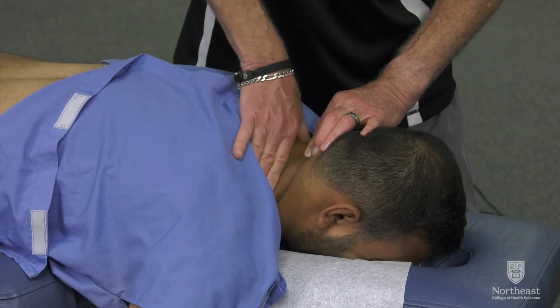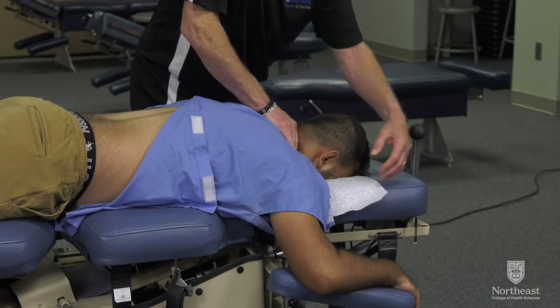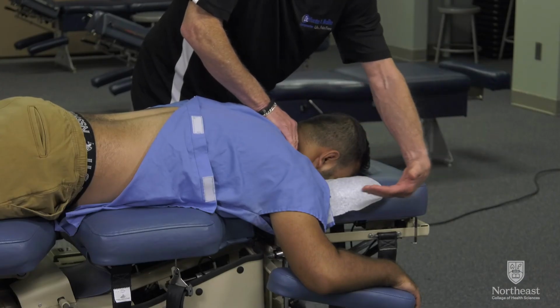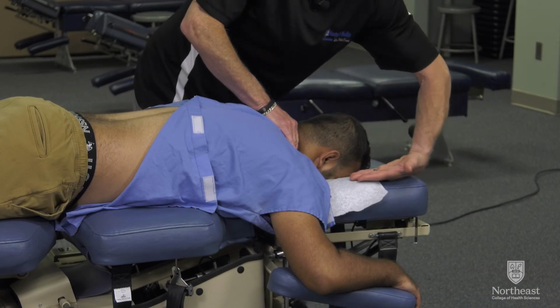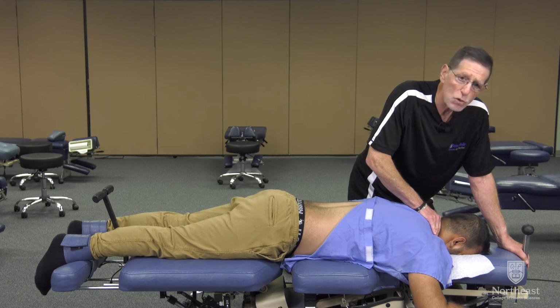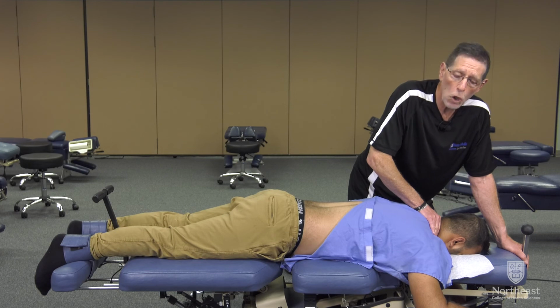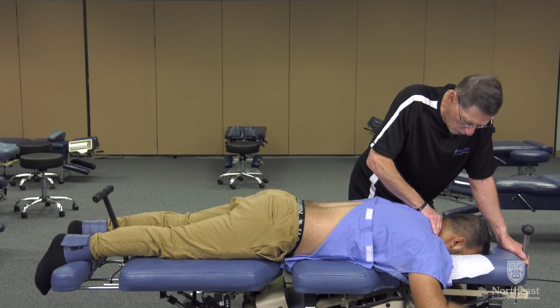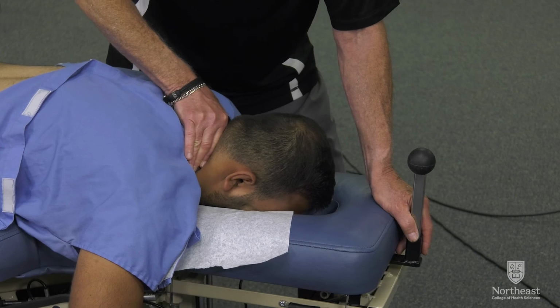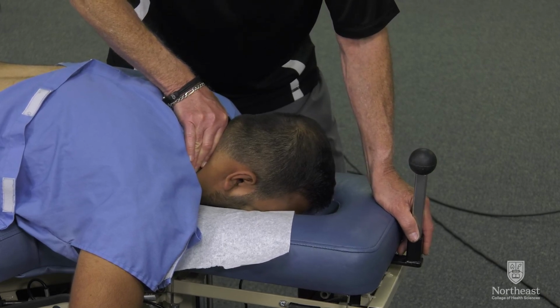And we would make our contact from below and come up onto C5 in a very firm manner. This table has long y-axis ability, so it can move in this direction. And then we would apply a little bit of that long y-axis force and make sure that this is tolerated. There's no increase of the patient's complaints. And from there, we would complete 5 slow, smooth, rhythmic repetitions from that taut point. So there's 1 and 2 and 3 and 4 and 5.